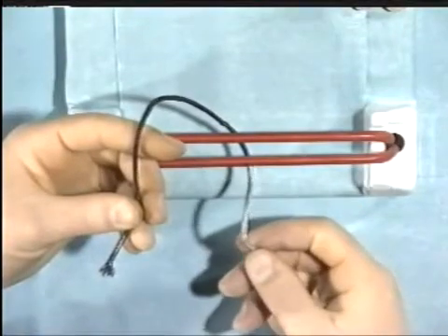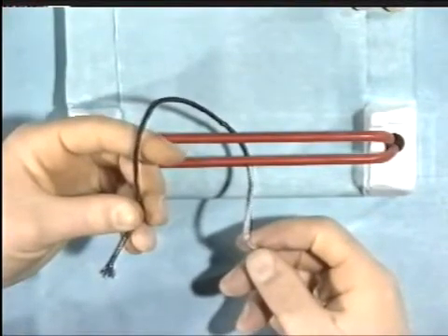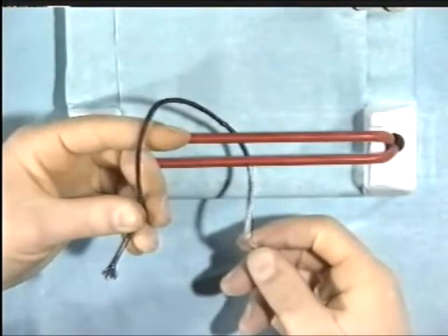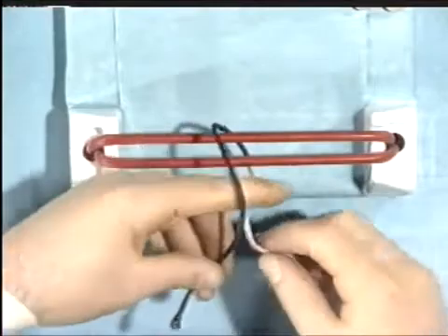Let's now demonstrate some common faults in knot tying. A satisfactory reef knot requires alternating throws of index finger and middle finger knots, crossing the hands with each throw.